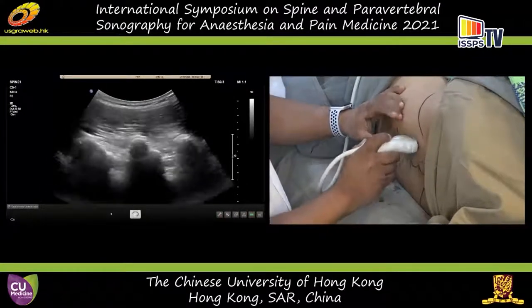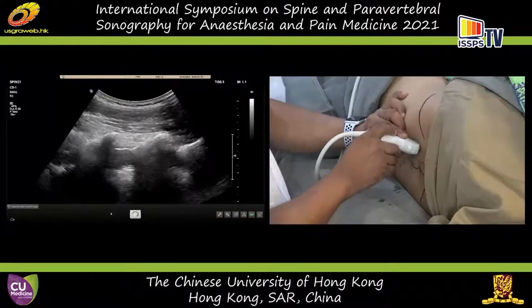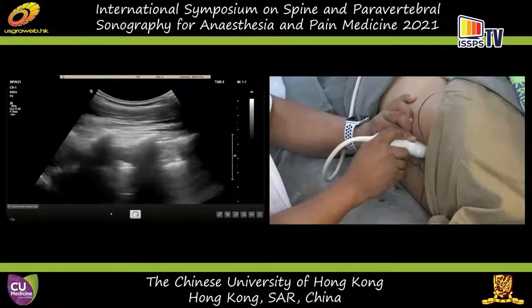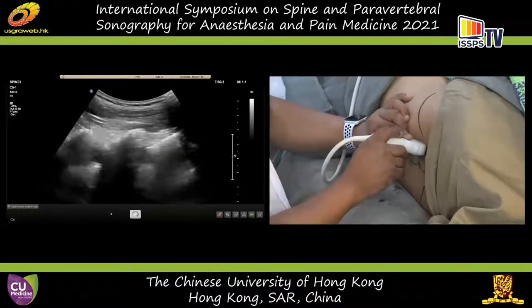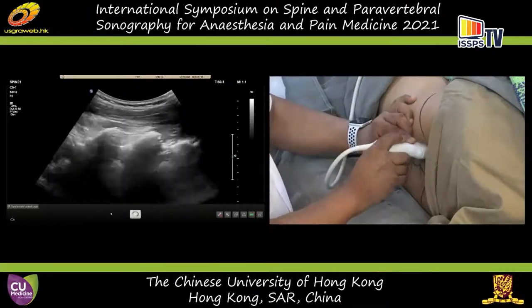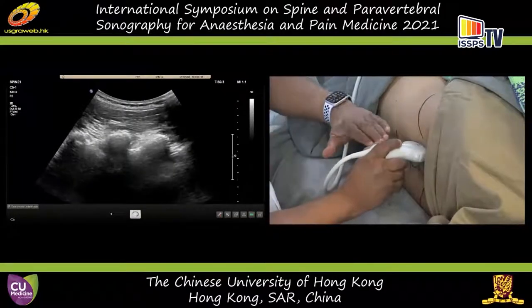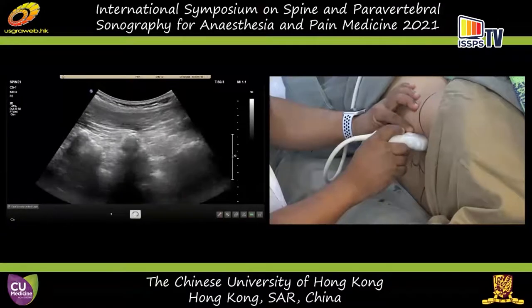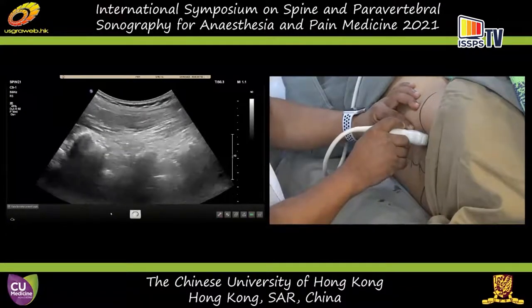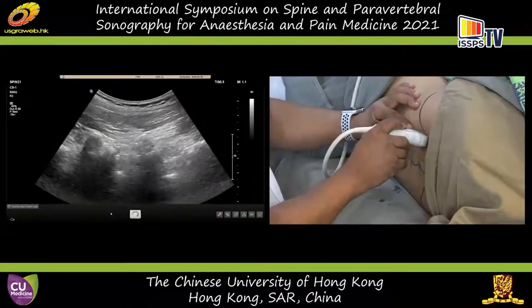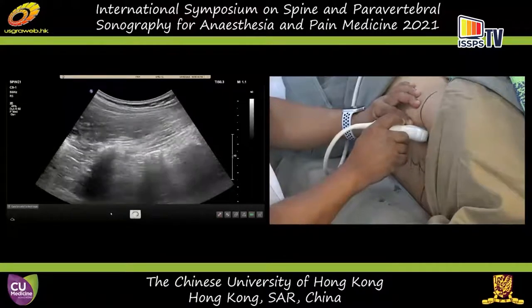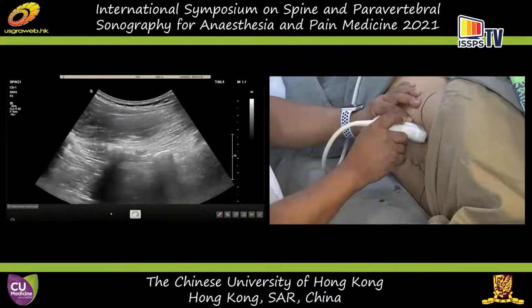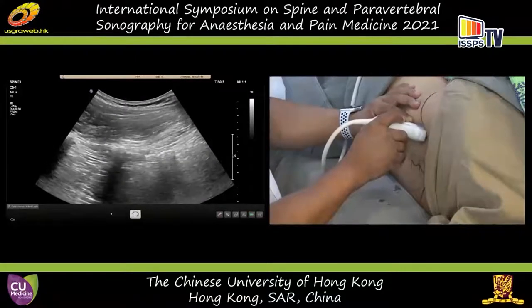I'd like to show you the adjacent anatomy. We are now at the sacrum, lumbosacral junction, L4-L5-S1. I'm going to move the transducer laterally. You can see here these are the articular processes — the articular pillars that form the facet joints. If you go further laterally, you can see the transverse processes and the acoustic shadows. Please increase the depth.